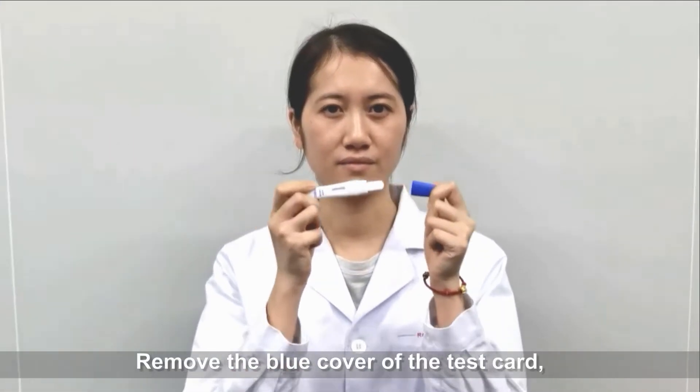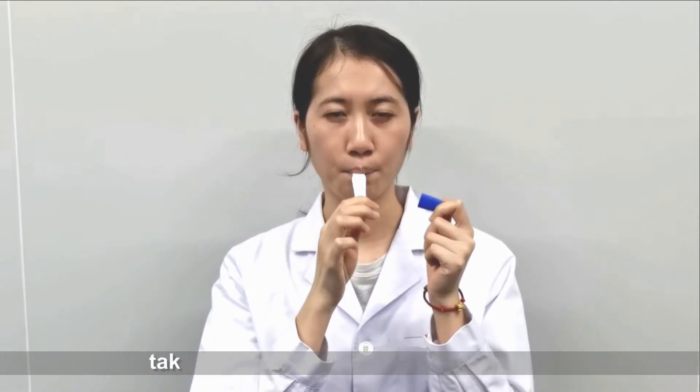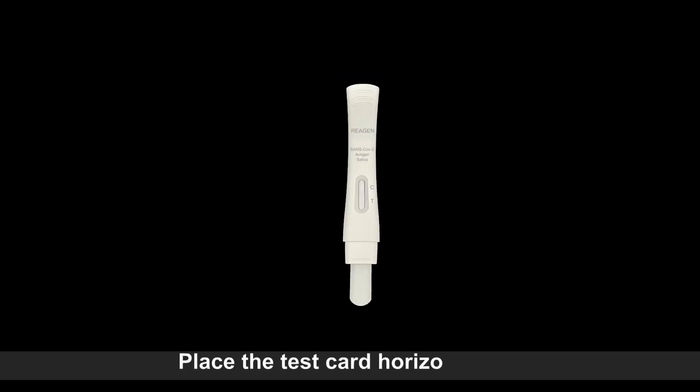Remove the blue cover of the test card. Put the absorbent tip of the test card into the mouth. Take out the test card after 2 minutes. Place the test card horizontally.